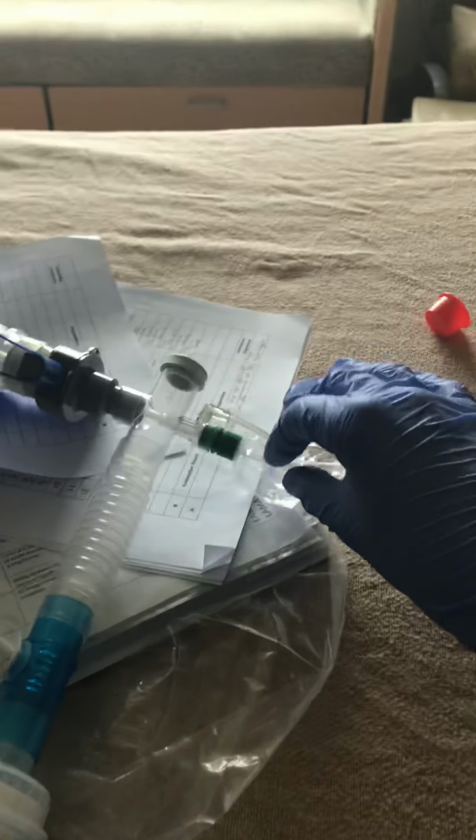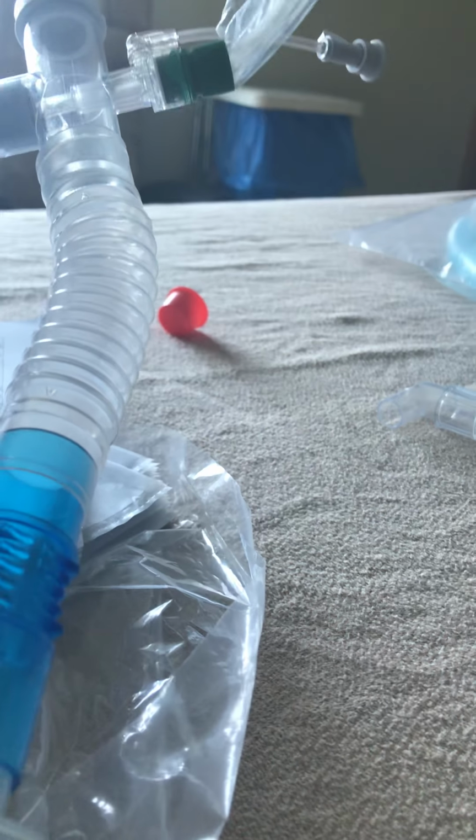So let's say we're going down and we either hit resistance or it's as far as we can go. If we hit resistance, we can go back up a little bit, and then we're able to press that in, nice and slow. You do have 15 seconds. We will suction that out. We want to make sure that this black piece here is all the way back, otherwise it'll cause resistance in the tube. The alarm.